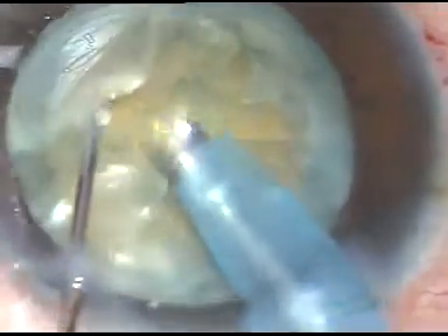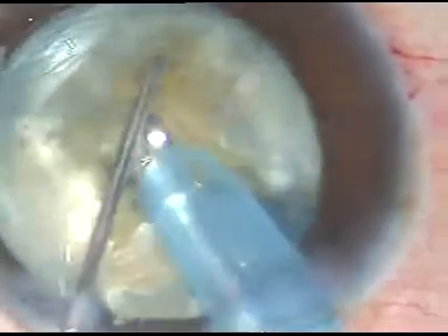However, I am making initial partial chops. Now what I do is sculpt deep at the center, and then I try to separate the nucleus into two halves — I have been successful in that. Once the nucleus is divided into two halves, we have almost conquered the hard cataract. The phaco power used in this case is 75%, flow rate is 45 ml per minute, and vacuum is 450 mmHg. The other hemi-nucleus has been flipped and is being emulsified and taken out.